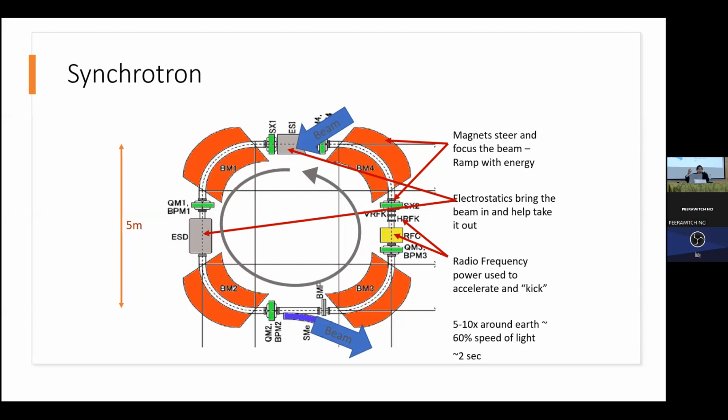And that way, again, if your injecting system, that admittance and acceptance, is well tuned, you're able to hold a lot of particles. And you don't need all those particles for one energy layer. You need them for several energy layers. So you're able to actually efficiently use everything you've injected. And then finally you run out, and then you re-inject and do the next cycle.